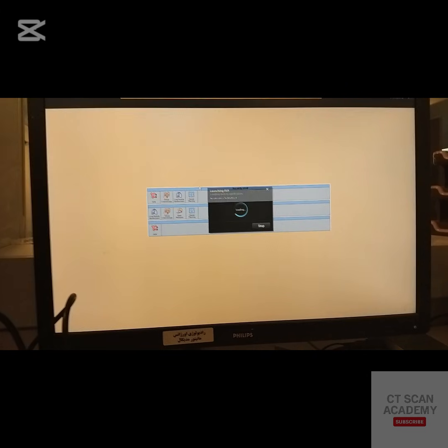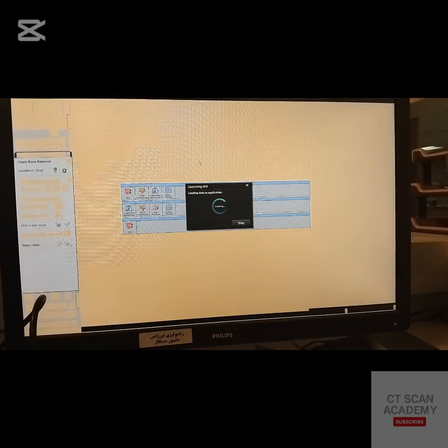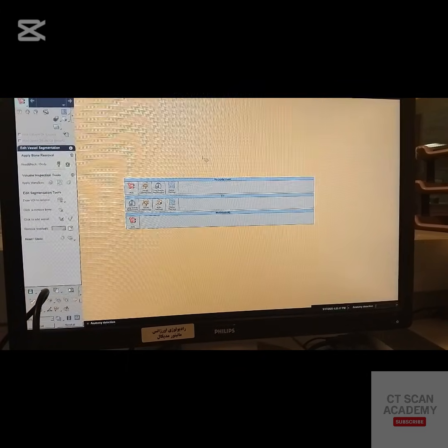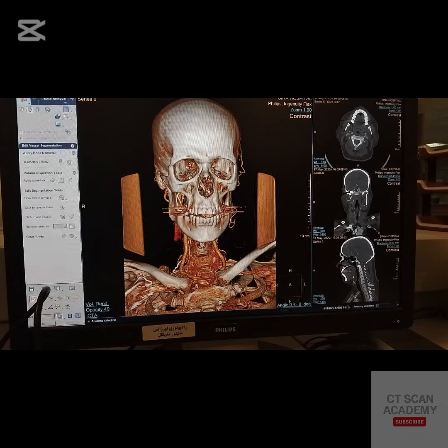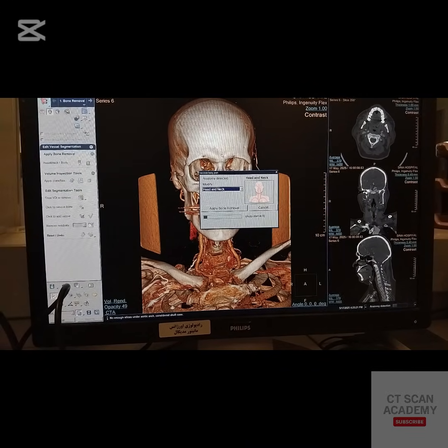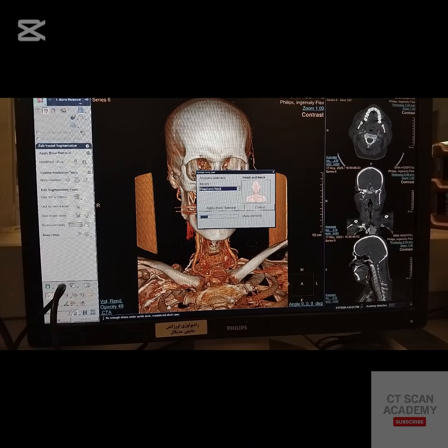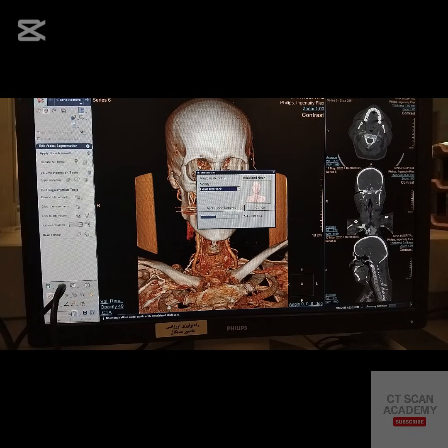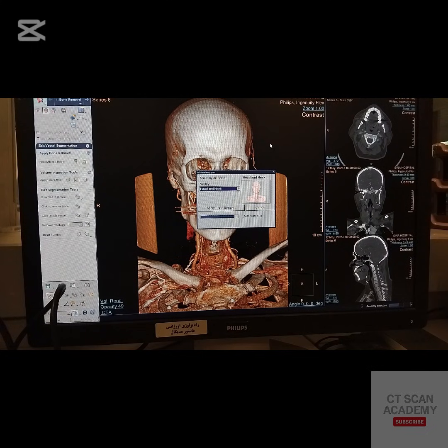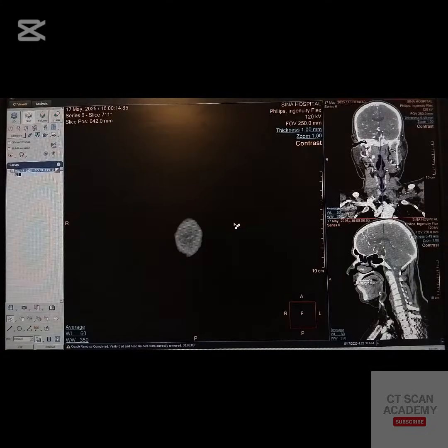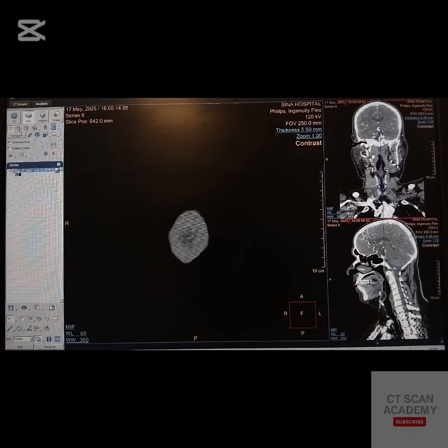Then move to the AVA application. AVA will auto-detect anatomy and begin bone removal. Once bone is removed, perform VRT reconstruction.